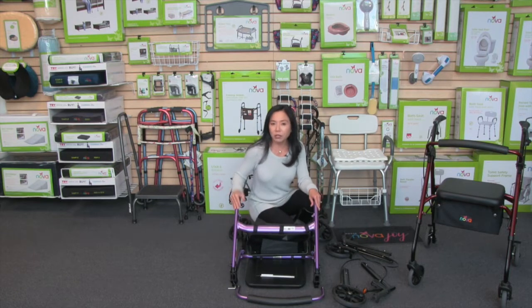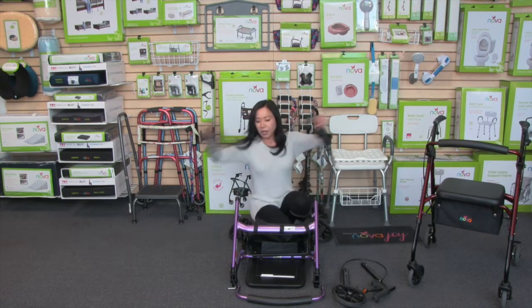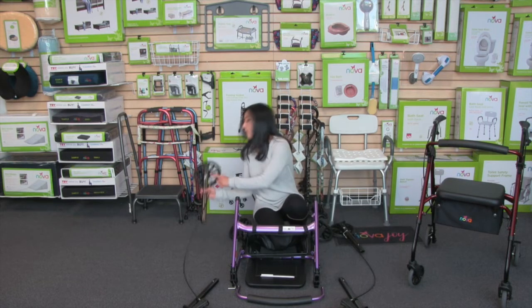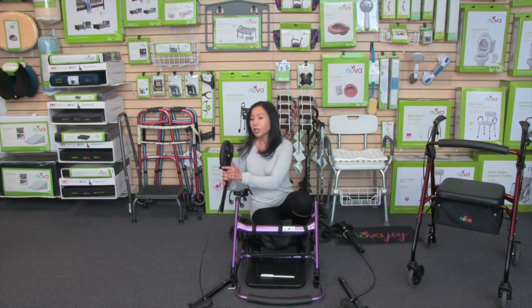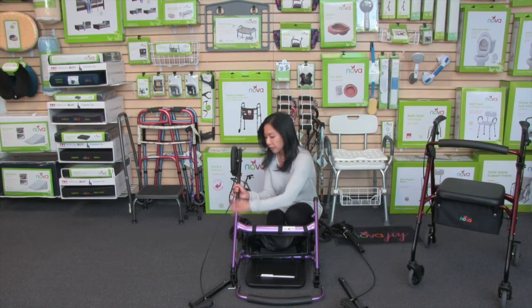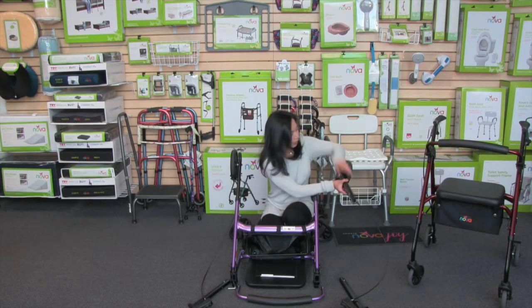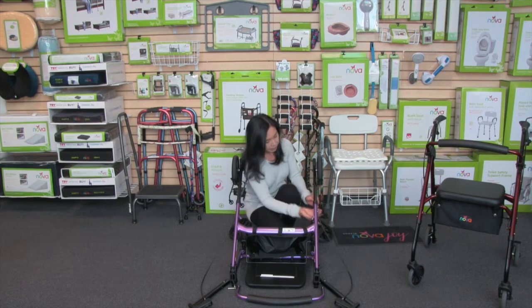For the back wheels and the brakes, you will see a sticker for the right and for the left. I have the right here, and I like to line it up to have the brakes up here and the wheel back here, and then the same with the left. You'll also see here is marked right. What you're going to want is the sticker facing inside, so that way the brake shoe faces outside. And same thing, you're going to insert, push both of the push buttons, and it'll lock into place. And then you're going to insert the cable into this holder right here. And then same with the other side. Sticker facing inward, give it a push, and it will lock into place, and then insert the cable.